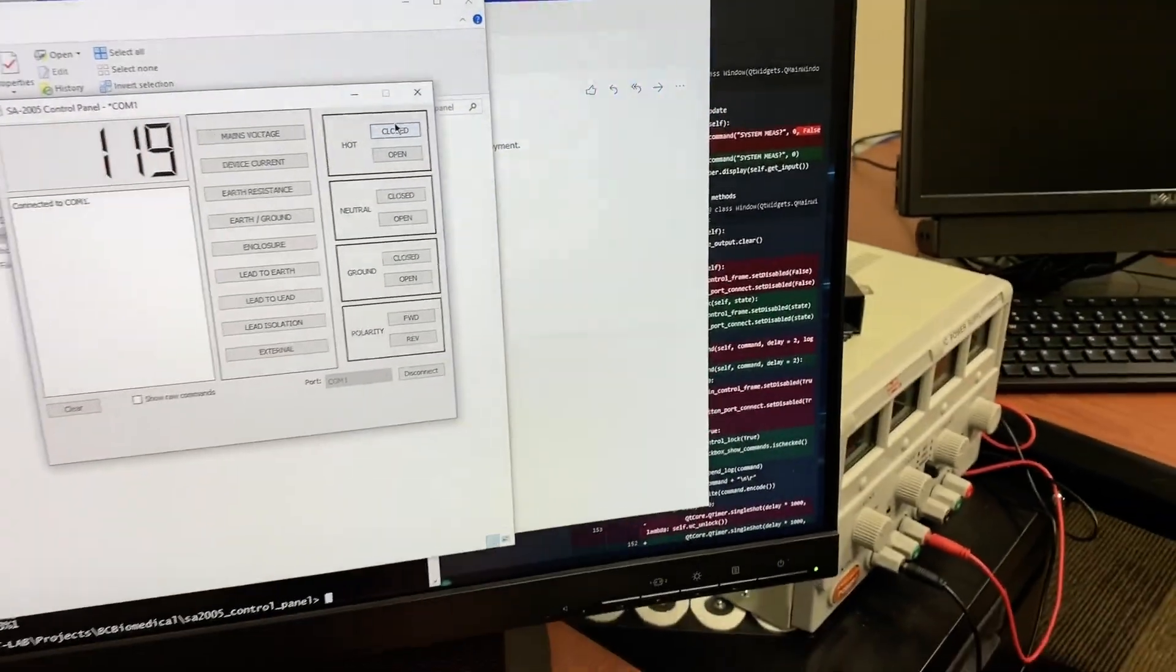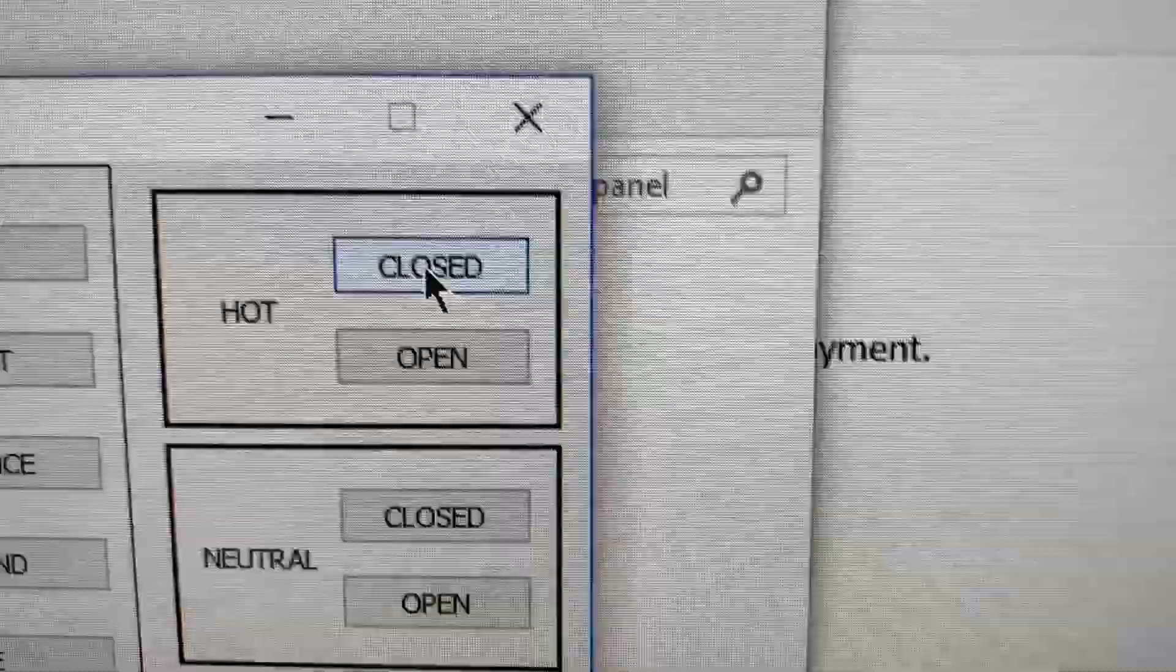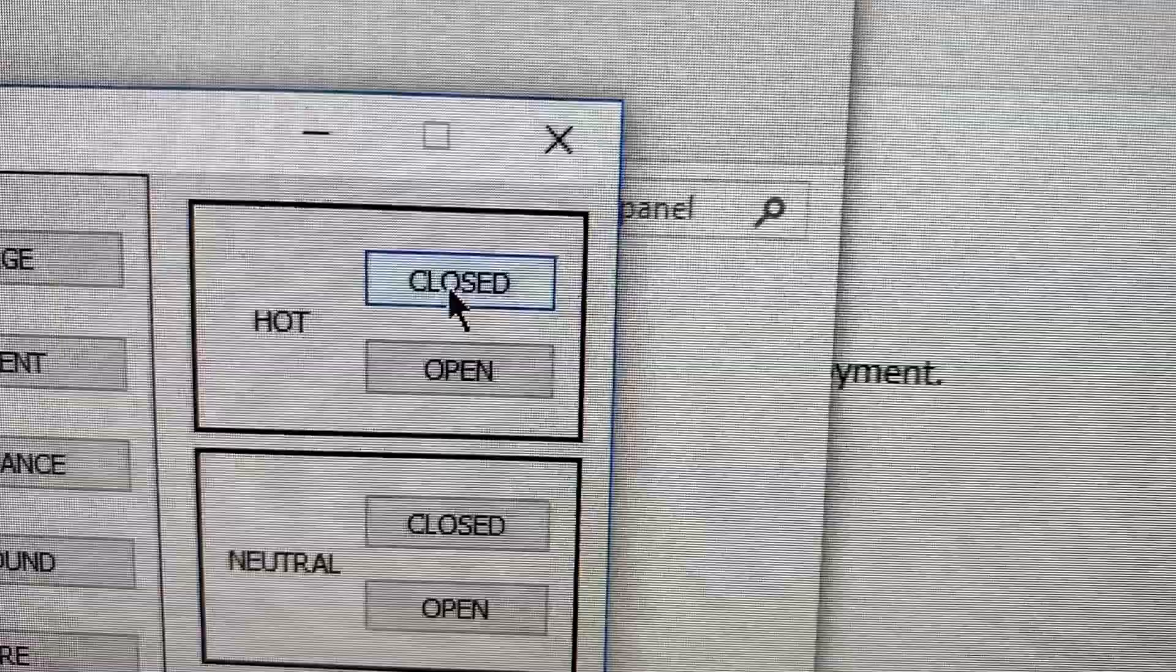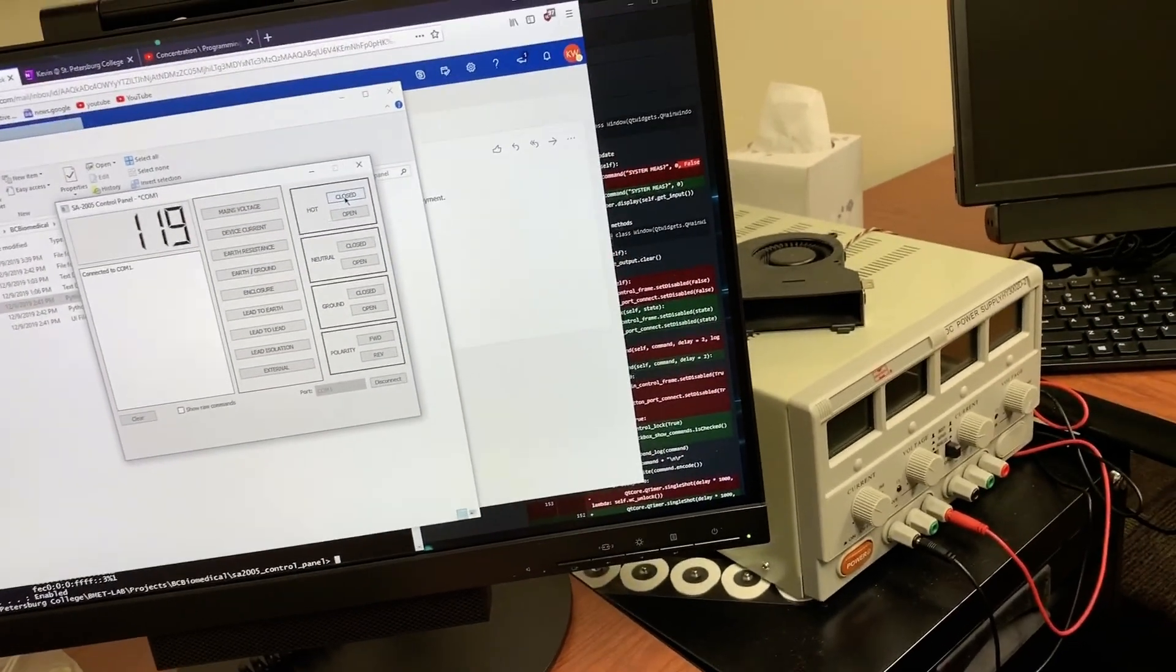And by using the right hand controls, I can control power flow for the hot, neutral, ground, and I can also change the polarity.